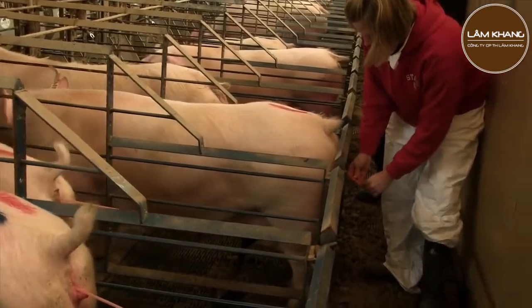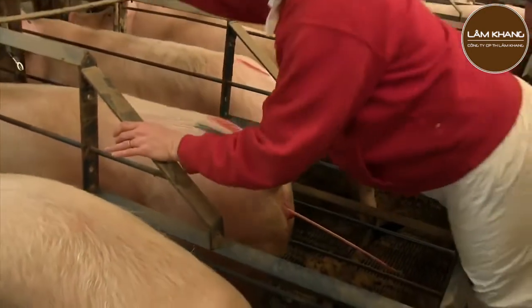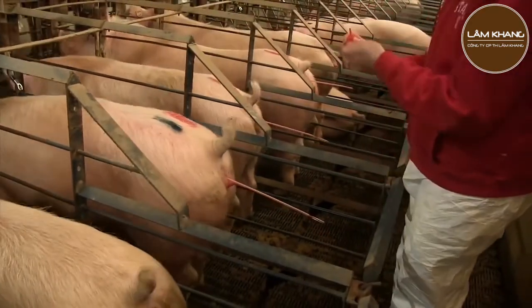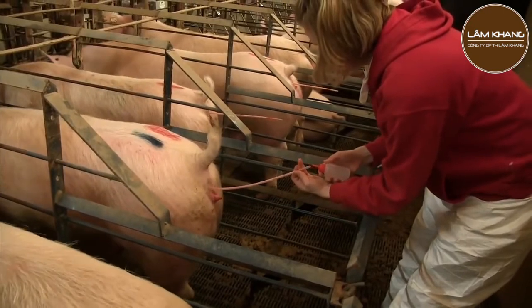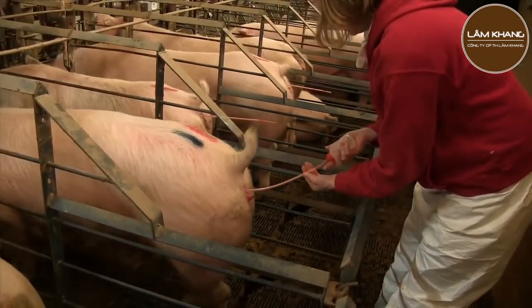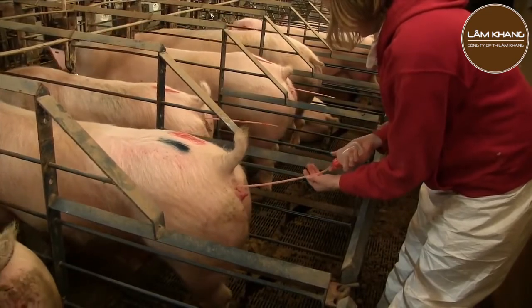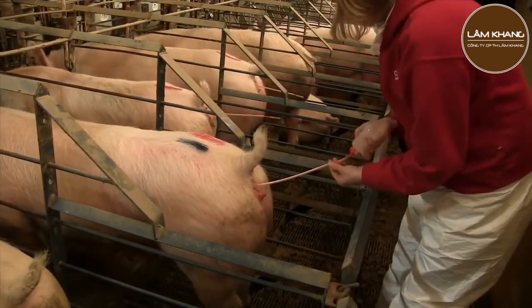Sometimes the sow's cervix will contract around the outer catheter once it stimulates the cervix. This could make it difficult to pass the inner catheter. The cervix should relax within about 20 seconds to allow the inner catheter to be placed. Then a semen dose can be connected to the end of the inner catheter and slight pressure placed on the tube, bottle, or bag until emptied into the sow.